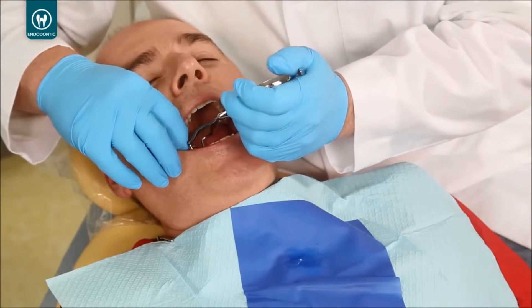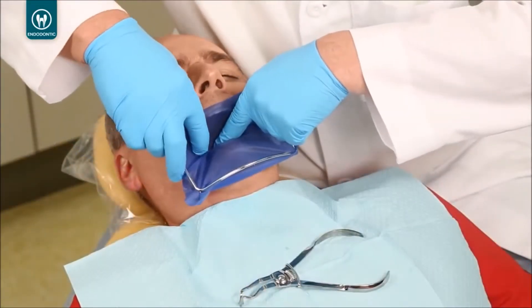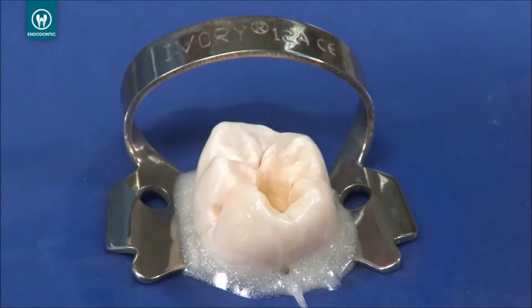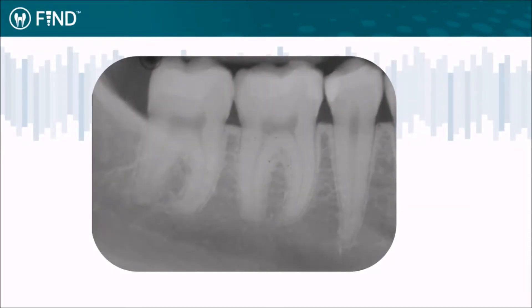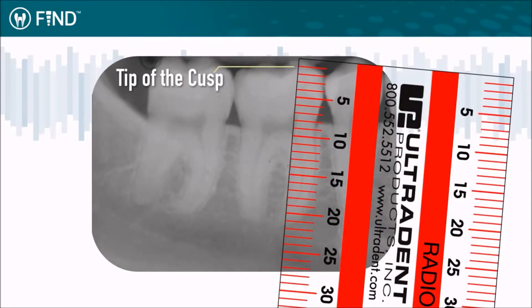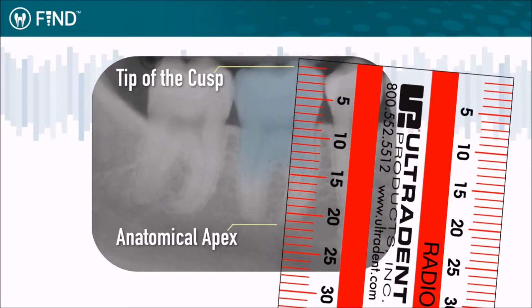To use the Find device, place rubber dam prior to beginning endodontic treatment. Use Opal Dam or Oraceal to prevent rubber dam leaks. Obtain an initial radiograph and measure the distance between a reference point, like the incisal edge or peak of the cusp, and the image of the anatomical apex of the canal you'll be working on. Subtract 5 mm to establish your temporary working length.